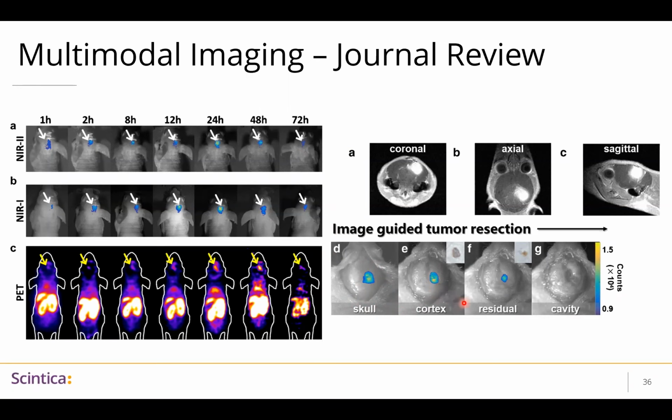The surgeon would then attempt to remove the tumor to what they felt was complete without removing too much normal tissue. Further imaging shows that there's some residual tissue left, which the surgeon would then resect and confirm that the tumor was fully resected. They then used histology to confirm that the resected tissue was in fact glioblastoma and that there wasn't a tremendous amount of normal tissue being resected as well. And they were able to confirm this again on histology.